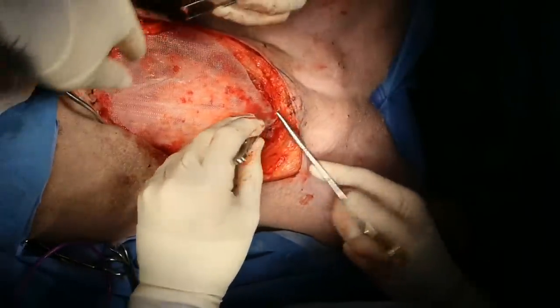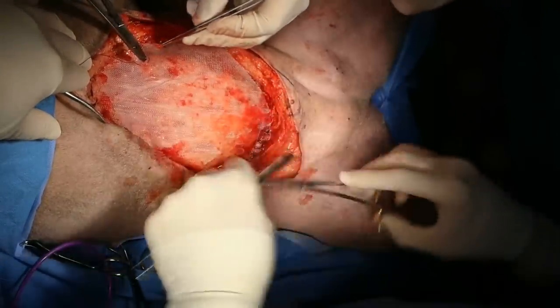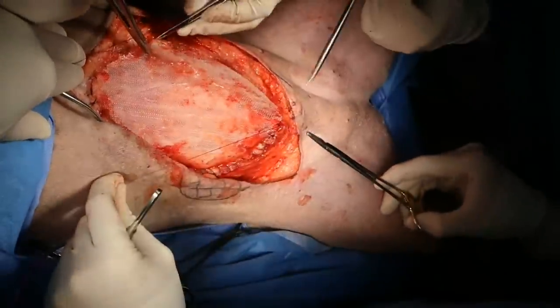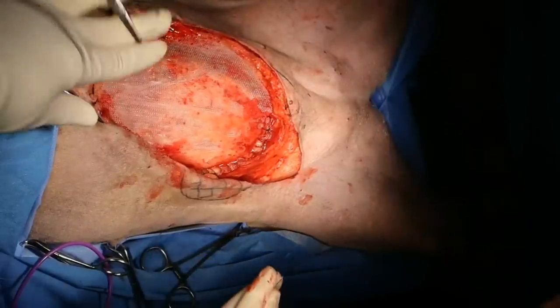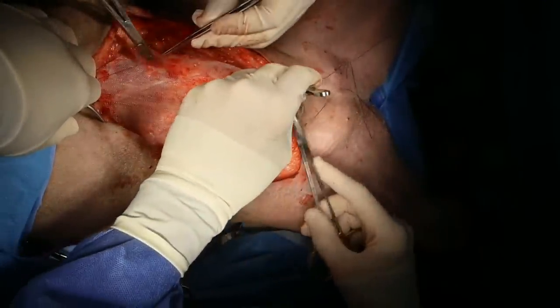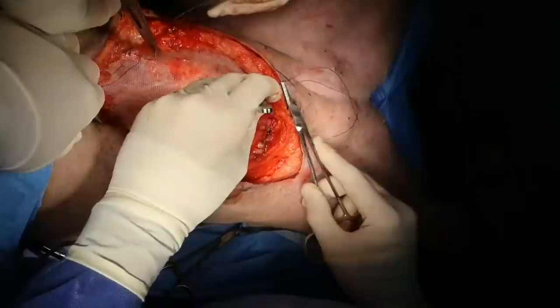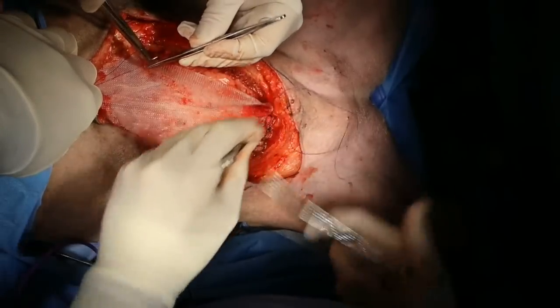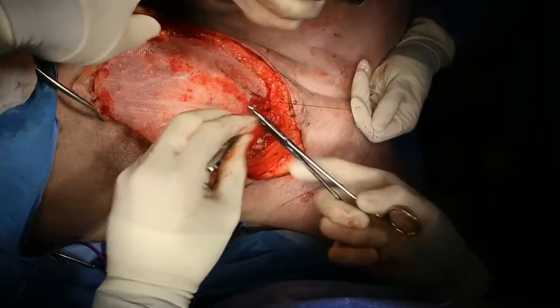So the one key thing with polypropylene is just making sure that you don't leave any gaps through which the intestinal contents could herniate. There's a question, Charles. Is there any benefit using two layers versus one of polypropylene mesh? Yeah, so when you're using polypropylene, this stuff is so strong, there's no advantage to using two layers as opposed to one. It's nice to keep the edge of the polypropylene outside the abdomen.